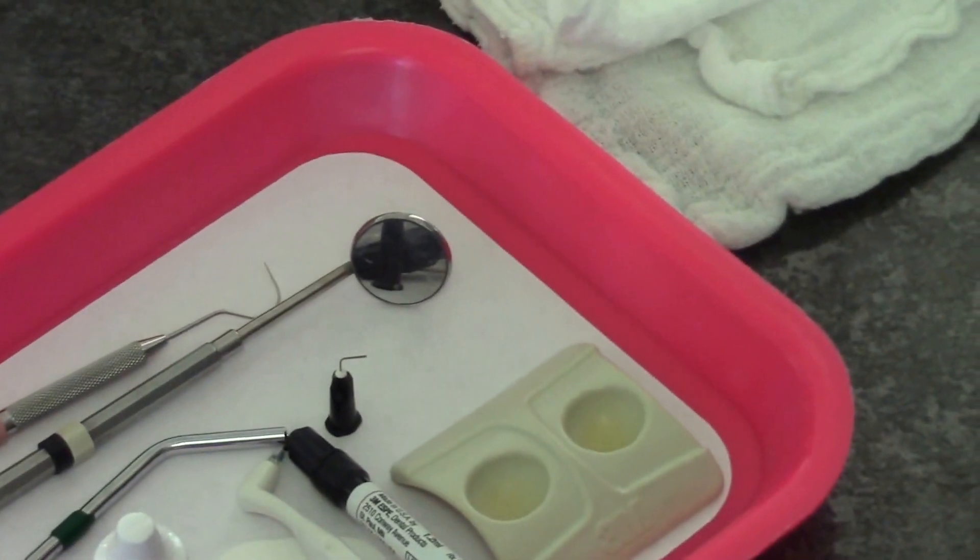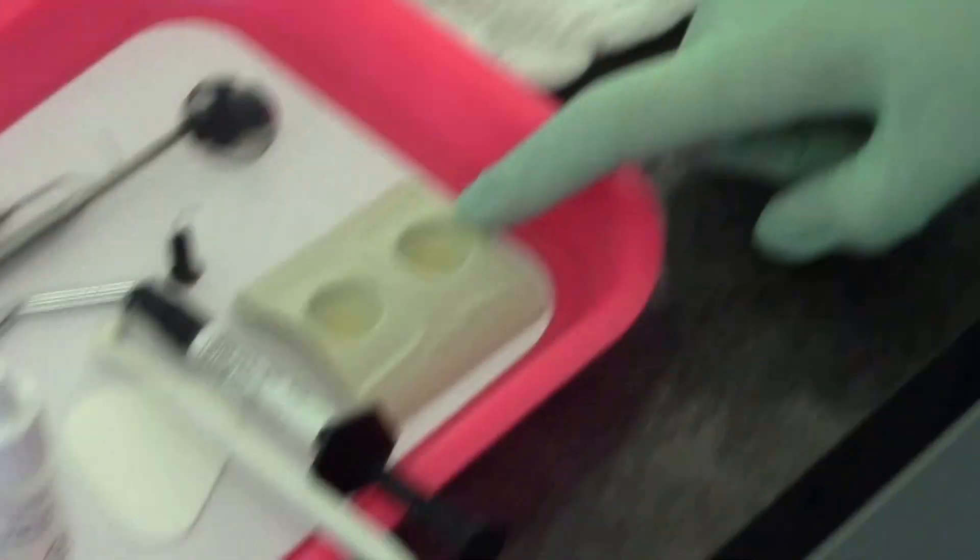All right, and then this one — this is our dapping dish. There we go. This is our micro prep.